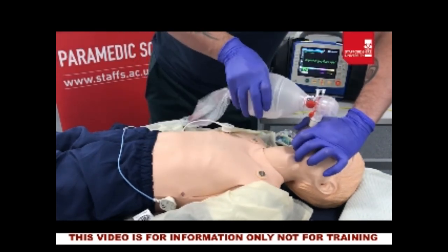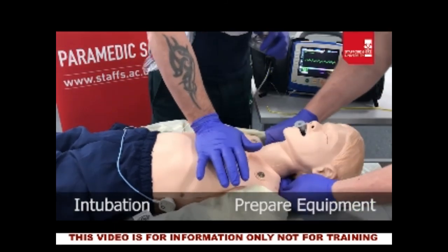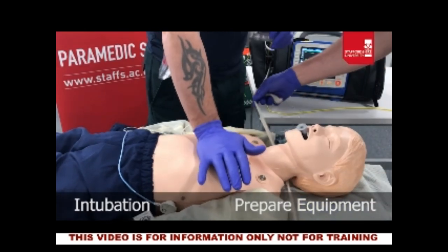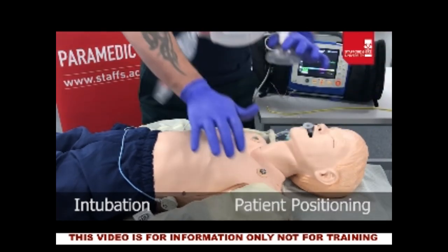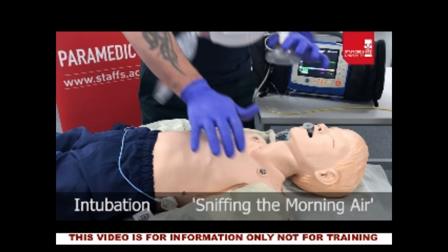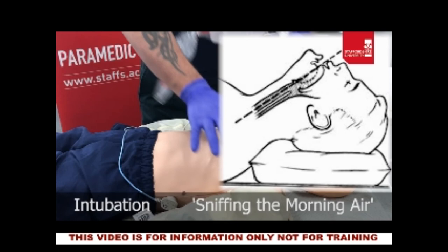Just like adult intubation, the first thing we need to do is prepare the equipment — the list is very similar with the main difference being sizing. Because of a lack of paediatric Thomas tube holders, we will secure the ET tube using a manual tie. Part of preparation is also patient positioning — for this patient we place them into the 'sniffing the morning air' position, bringing the tragus of the ear into approximate line with the sternal notch to facilitate a better angle of view down the length of the trachea.